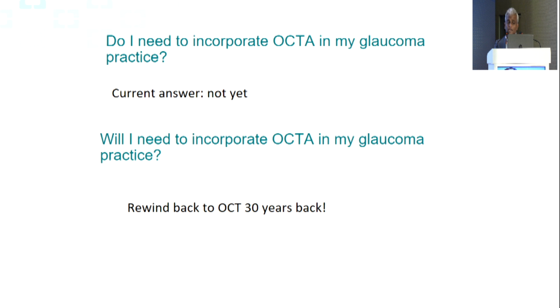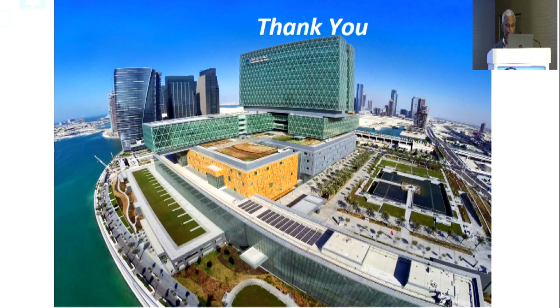And if you look at it, do I need to incorporate OCTA in glaucoma practice at this point in time? Not yet, probably. But will I need to do it in the future? You need to rewind back to using the OCT in retina 30 years ago, and we all thought it would just be a fancy tool, and it's not. It's a game-changing tool. So that could happen. Thank you.